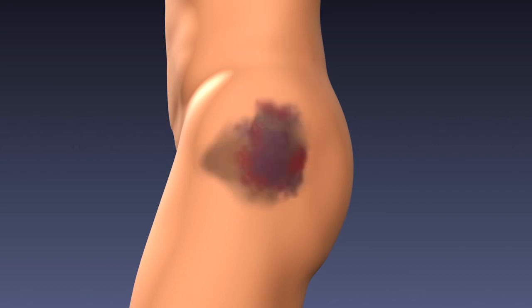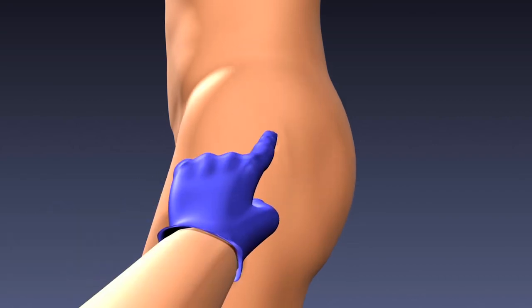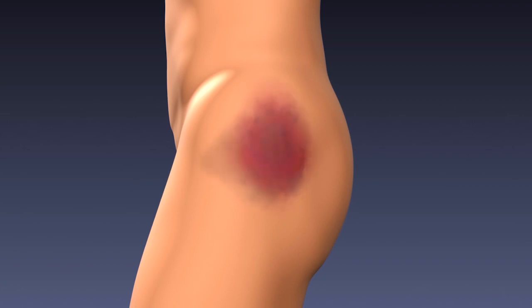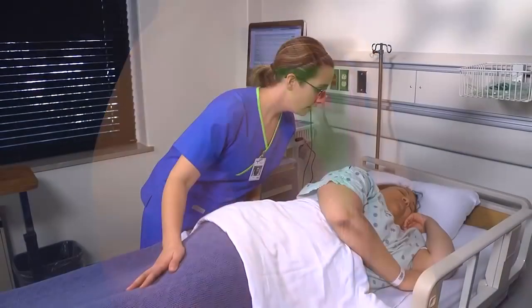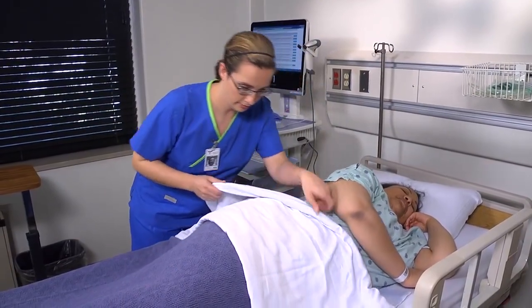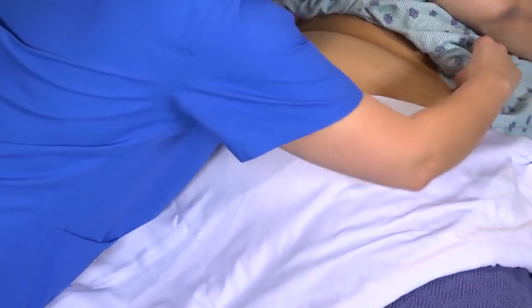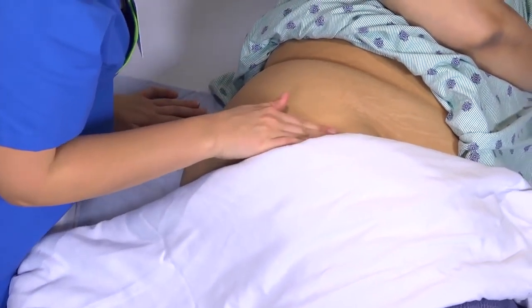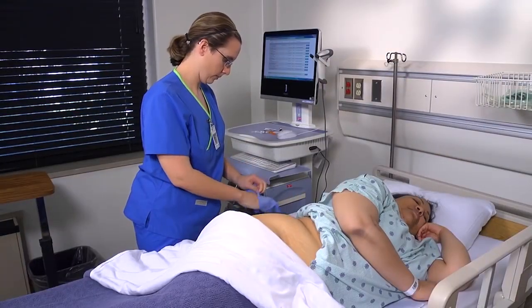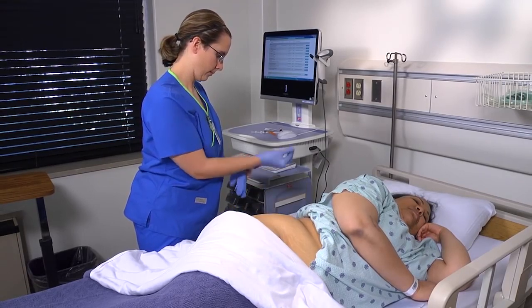Inspect the area for bruising, inflammation, and edema. If the skin is bruised or shows signs of infection, use a different site. Help the patient find a comfortable position that will accommodate the injection site you've chosen. Expose only that portion of the body. Apply clean gloves and use anatomical landmarks to find the site again.